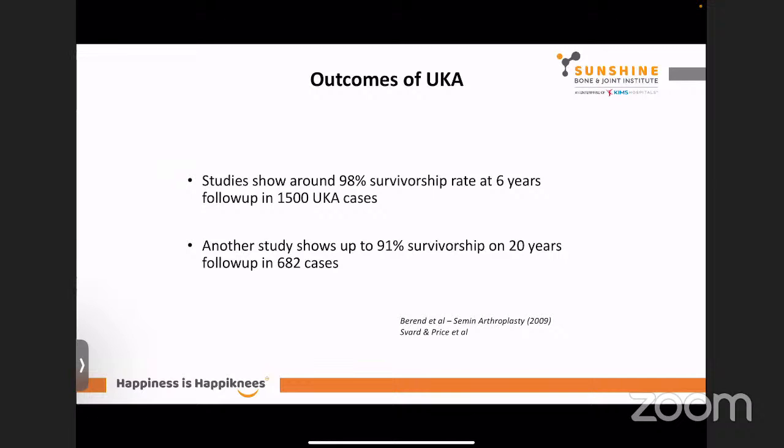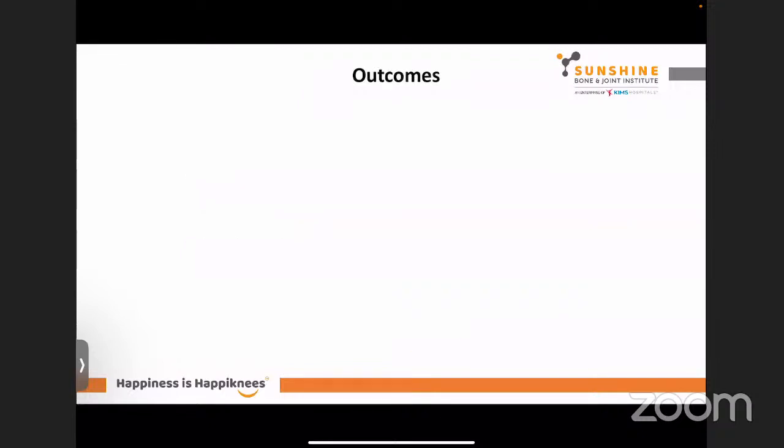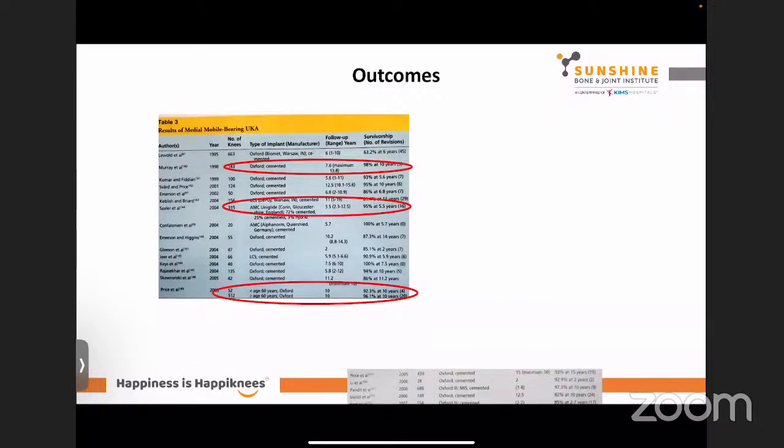sturdy. So the studies show around 98% survivorship at 6 years in a case of 1,500 unis. Another study, 91% at 20 years in a follow-up in 682 cases. These are the two studies you can have a look at. And all these studies show very, very good results.